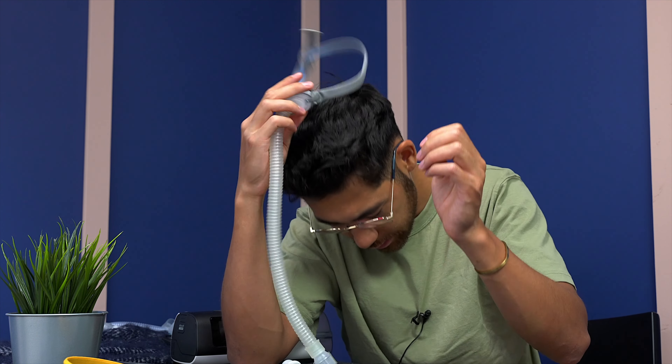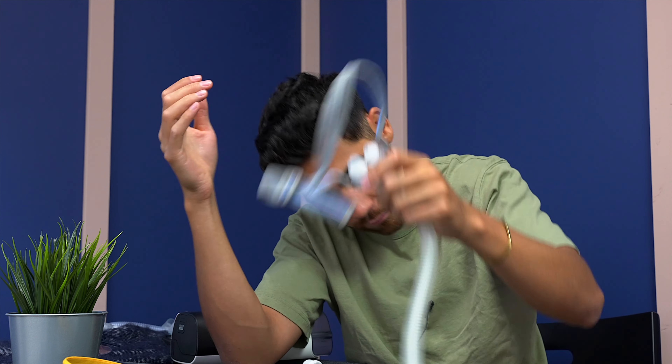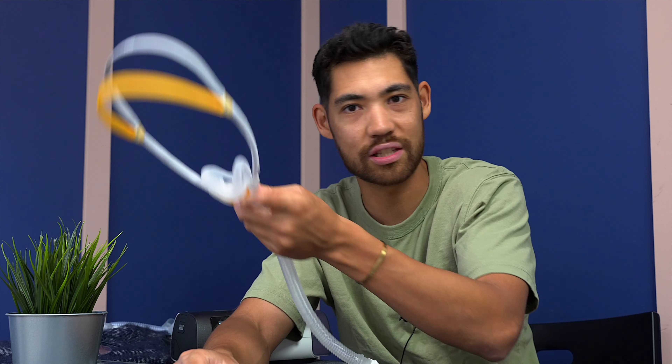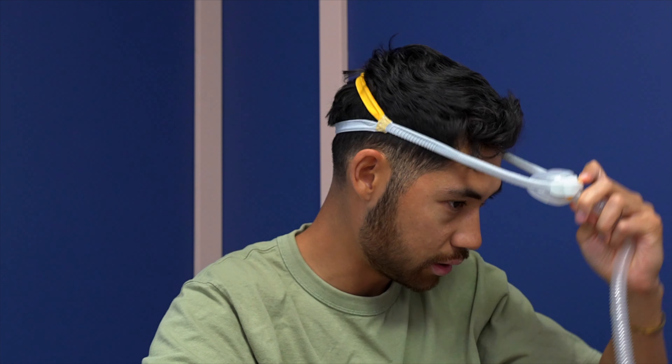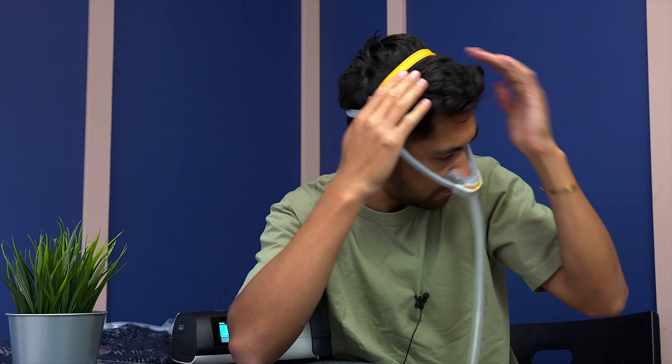In terms of headgear ergonomics — putting them on — which one's better? With the P10, it's pretty easy. I'll take off my glasses. It's so minimal and very elastic, it just splays out to the side and it's on my face. Pretty simple. But what if you have dexterity issues? What if you have arthritis, or you only have one hand? The Solo is amazing for that. It's similar to the Evora nasal with its baseball cap design. You grip the back of the head, pull it forward — boom — one hand. You can adjust the top if you want, and one hand is all you need.